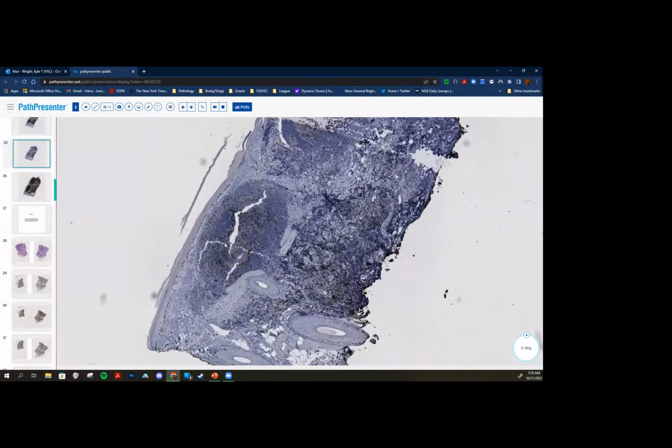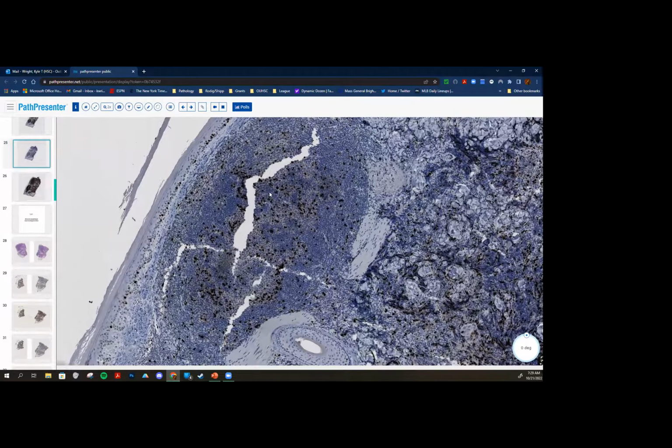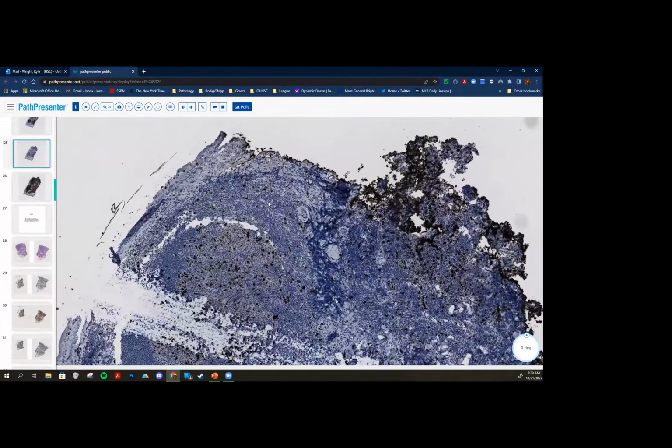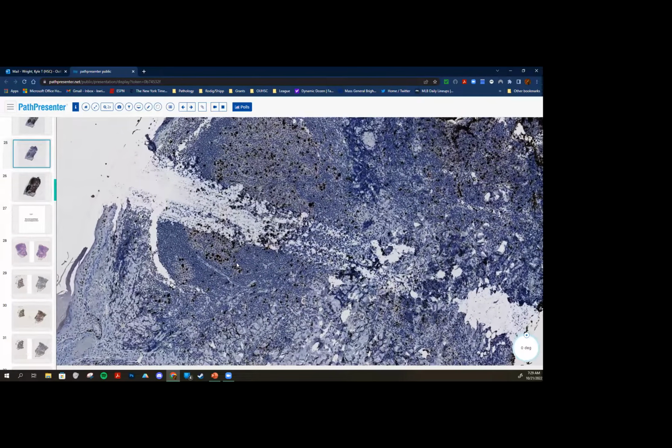This is a marker for proliferative index, right? So proliferative cells are positive, and you can see this is fairly low throughout, maybe 5 to 10% in these areas. This is atypical for a germinal center. Remember that a normal germinal center is a proliferative process, so you'd expect the proliferative rate to be fairly high and polarized. Remember that follicles are typically polarized into light zones and dark zones. You see breakdown of that here.